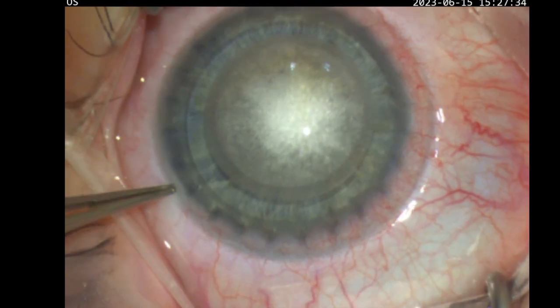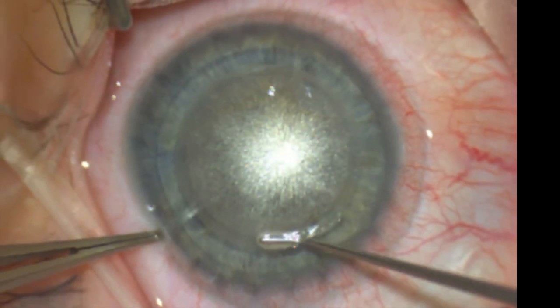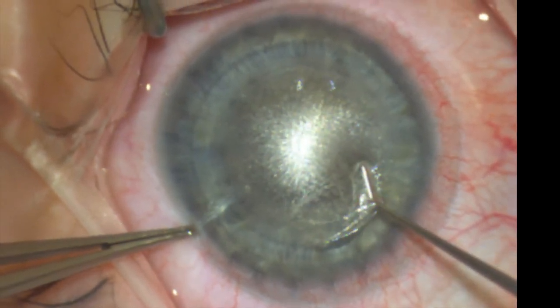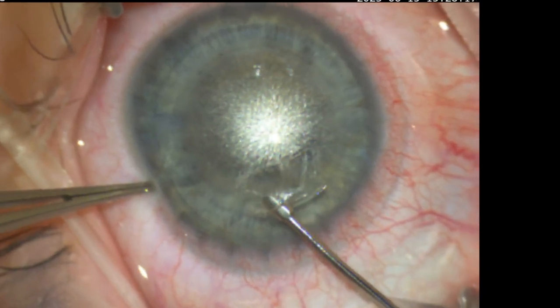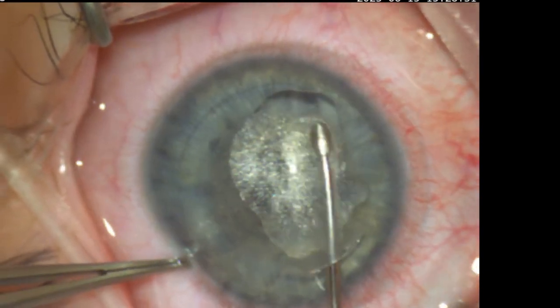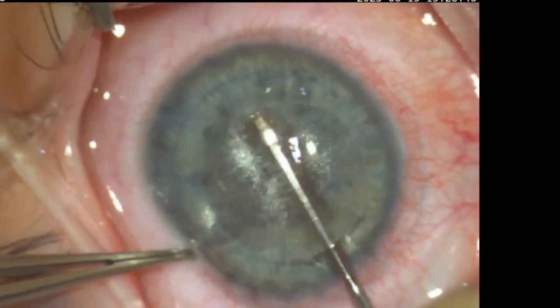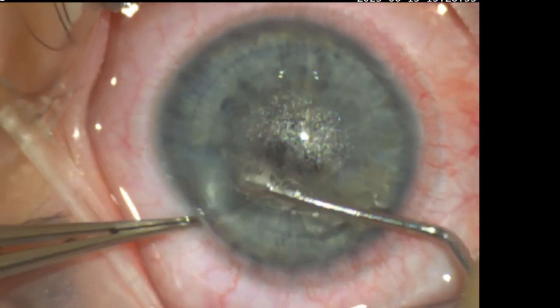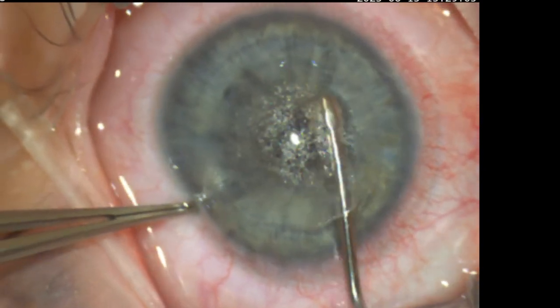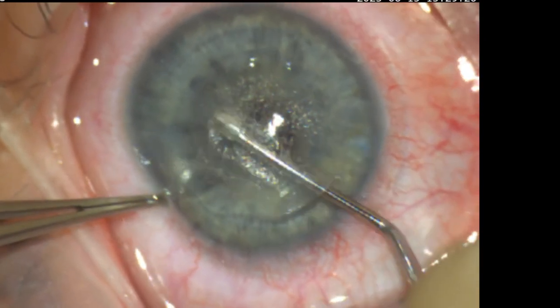The eye is numbed with anaesthetic, and then the anterior followed by the posterior planes are identified. The spatula is gently introduced firstly over the anterior cap plane with gentle sweeping motions, as you see here, and then followed by the posterior lenticular plane. A small area opposite the keyhole entry is left undissected until the end.